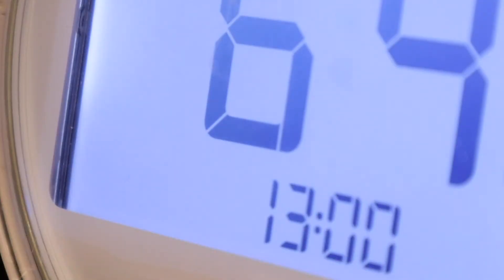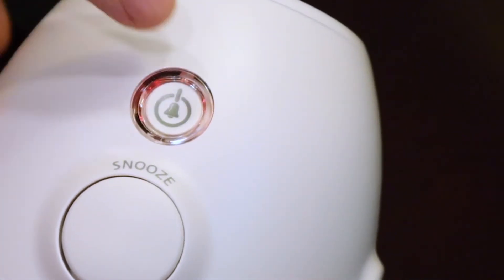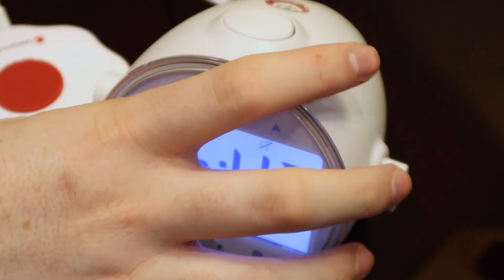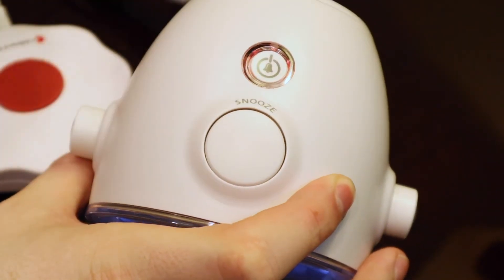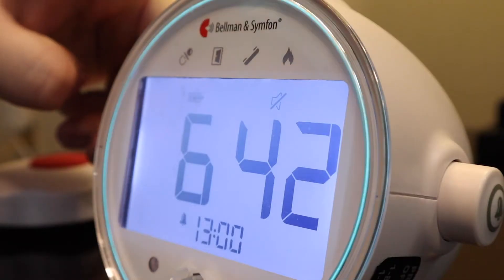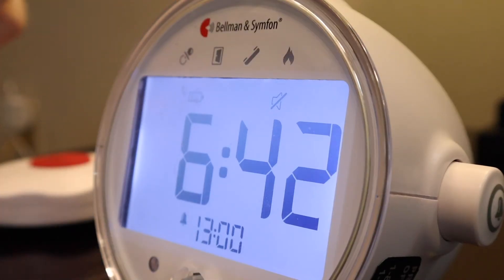The alarm function can be turned on or off. Press the top alarm button to toggle this setting. The snooze button will silence an alarm for a brief time before it alerts again. Holding the snooze button for three seconds will turn on the night light function. To turn it off, press the button again.